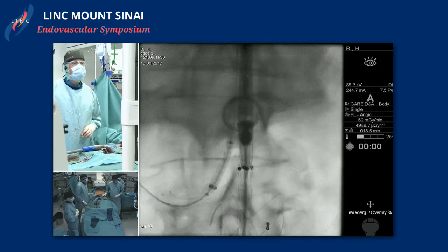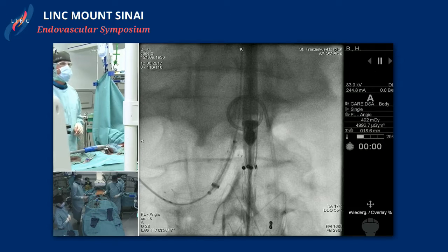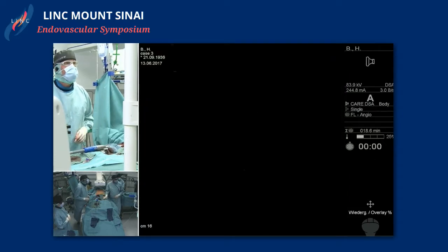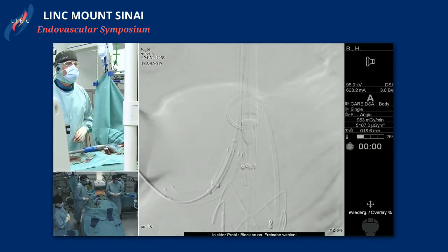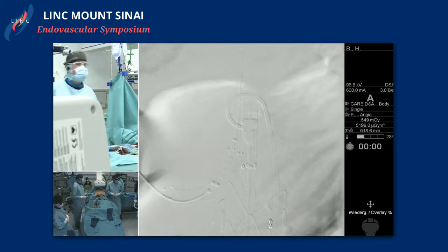Well, I think the relining is not just to enhance radial force. Especially with balloon expandable stents, I tend to really make sure that I extend it beyond the end of that first stent to avoid any kinking or problems later on. That transition, I think, is very helpful.